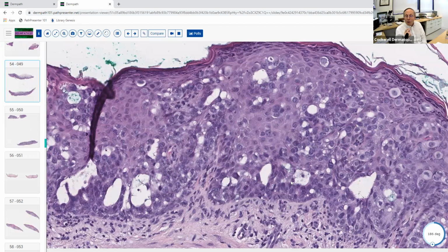If you wanted to stain this, you'd say, well, I'm not really 100% sure. It doesn't have any glandular epithelium in it this time. And then we just want to make sure it's not Paget's disease versus Pagetoid Bowen's disease versus melanoma in situ versus MF versus sebaceous carcinoma, et cetera. You would want to stain it for specific markers. Cytokeratin 7, carcinoembryonic antigen, and stains for mucin would all highlight this lesion strongly in this case.